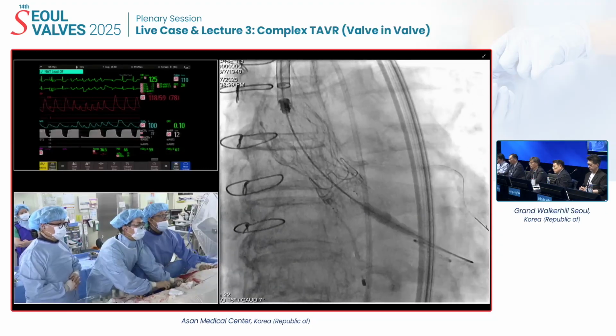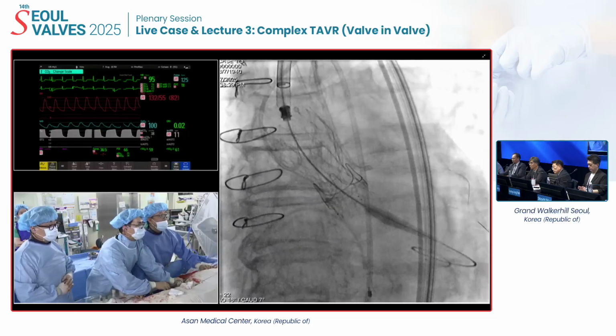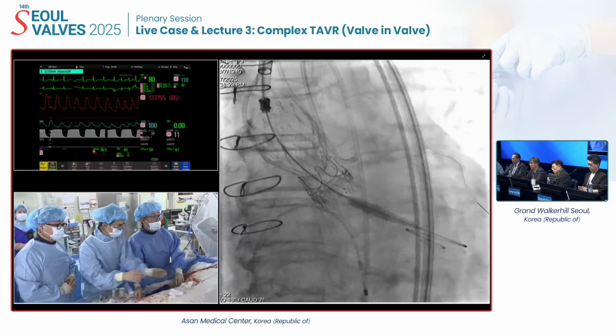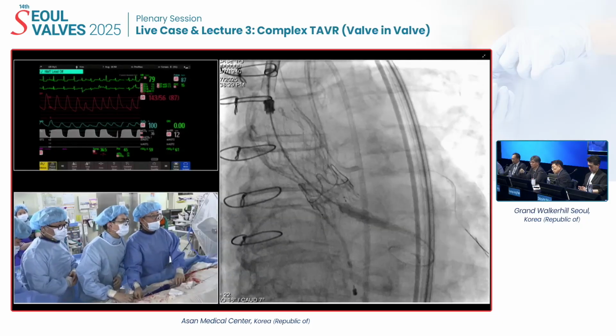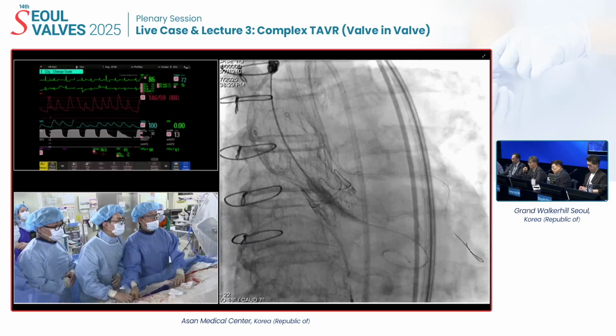오케이. Access 릴리스. 완전 릴리스. 더 릴리스. 얘가 하나 안 풀렸어. 조금 더. 오케이. 됐다. 오케이. Here. And then the release. 오케이. 잠깐만. 노즈 컨트롤 살짝 뺄게. Okay. 안 걸리게. 오케이. Good.